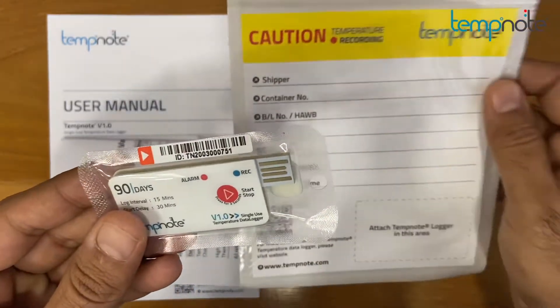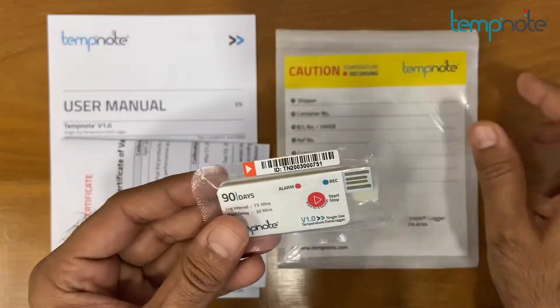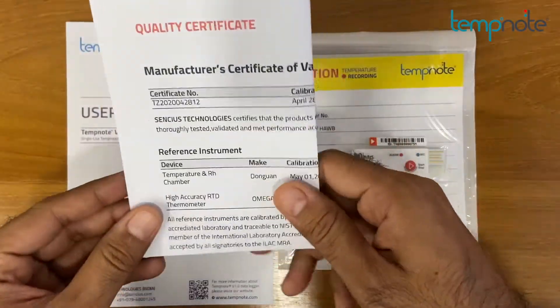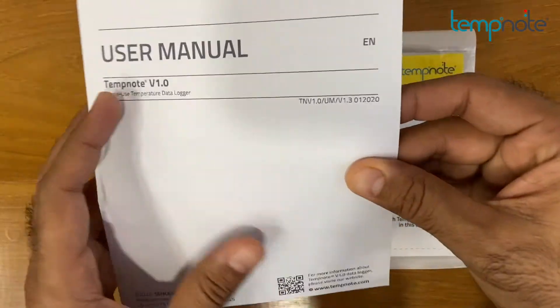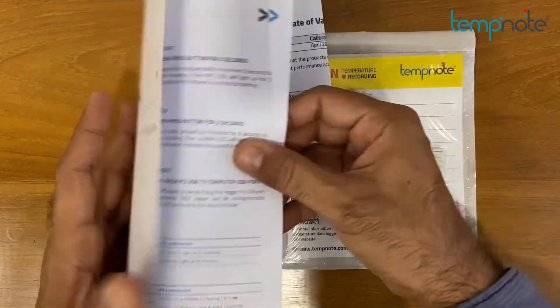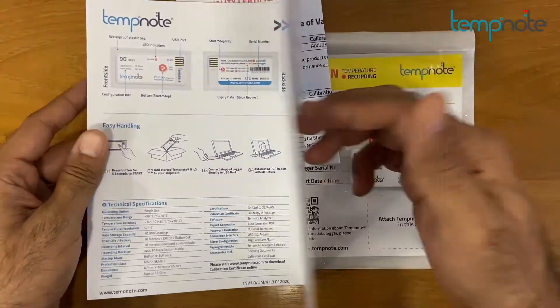TempNote V1 comes with a temperature monitoring sheet with adhesive pouch, a manufacturer's certificate of validation to comply with quality standards, and a user manual that includes an overview of operating instructions and technical specifications of TempNote V1.